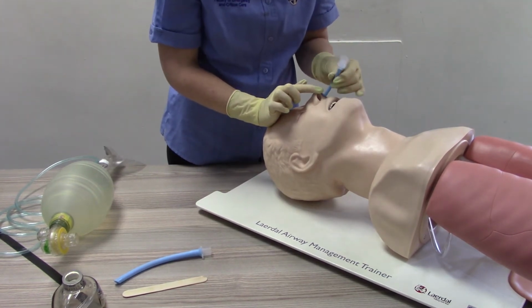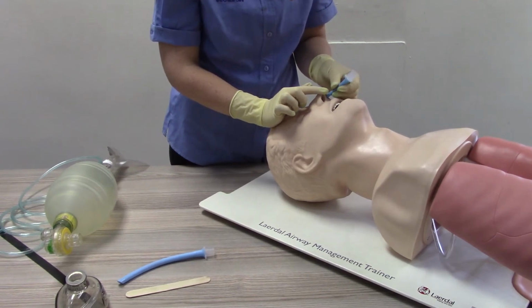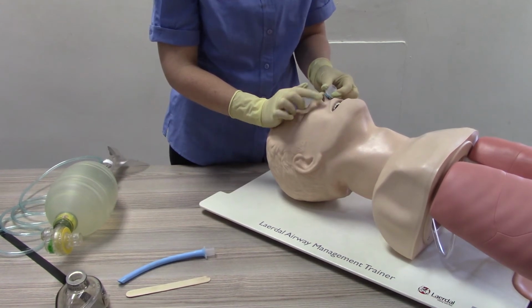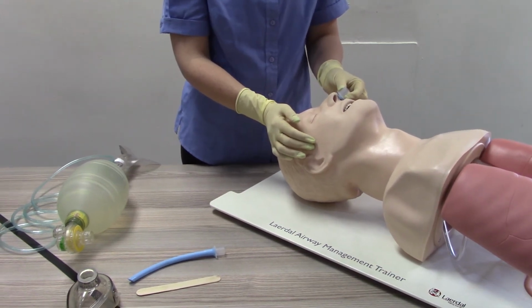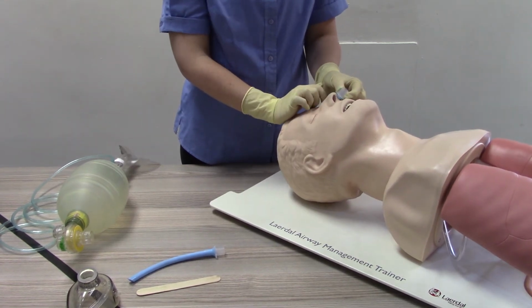If resistance is encountered in the second nostril, rotate the tube to facilitate gentle advancement. If resistance cannot be overcome, remove the tube and abandon the attempt. If no resistance, insert the nasopharyngeal tube until the flange or the safety pin is flush against the patient's nose.